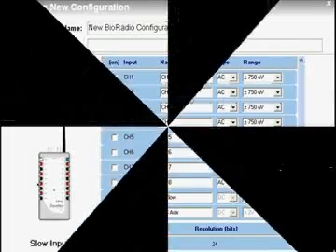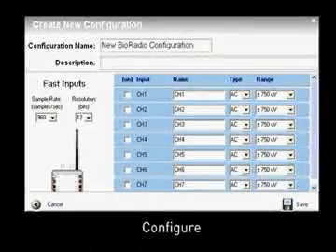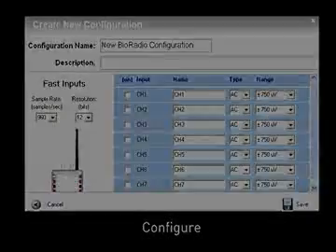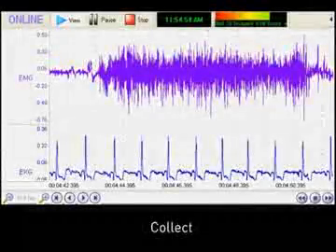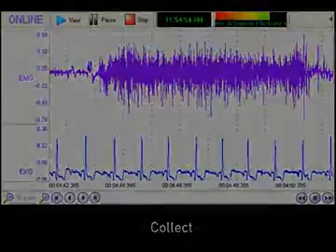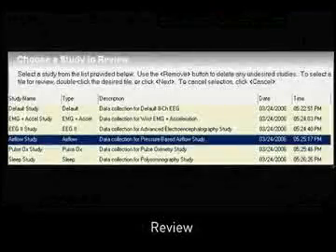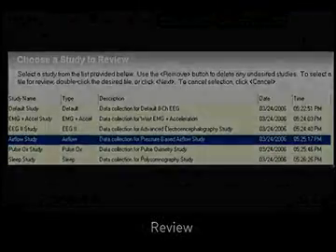In addition to the state-of-the-art hardware, the BioCapture software allows users to configure, collect, review, and analyze data in real-time or offline.